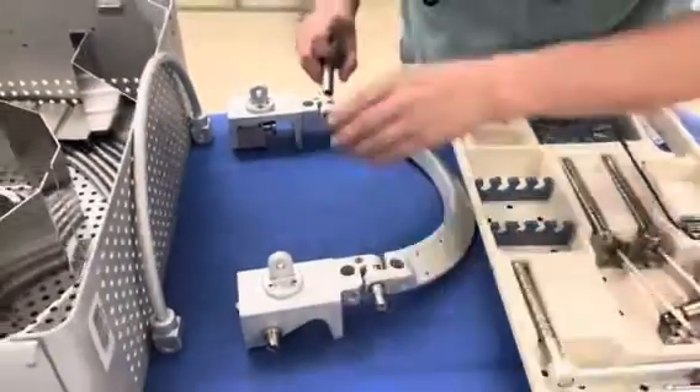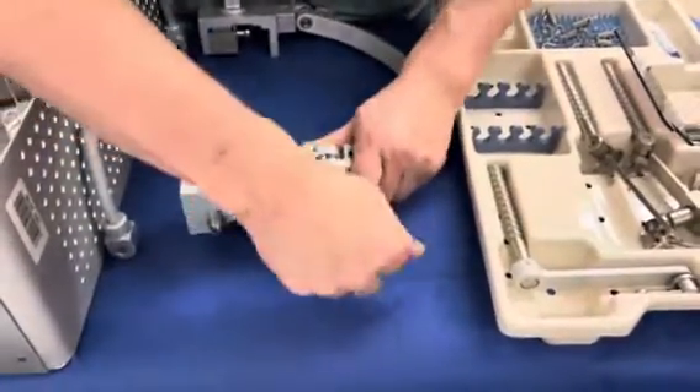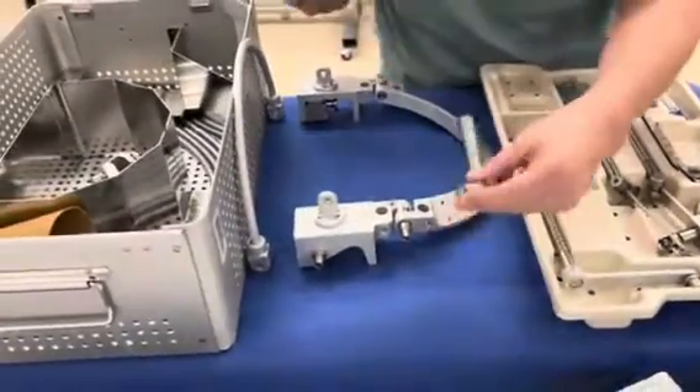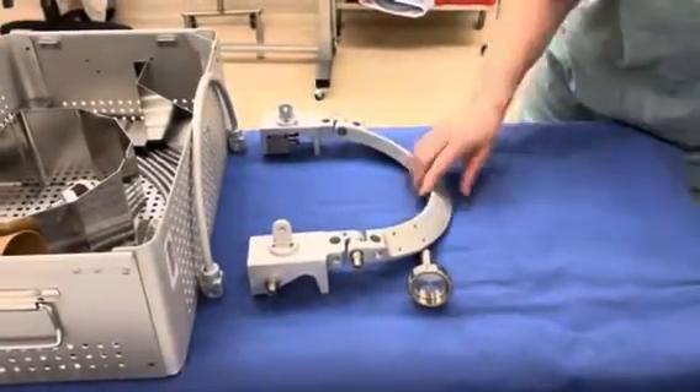Then we're going to take the wrench just to secure it nice and tight. Always have the wrench nearby too, because if the surgeon wants to lower it, they'll take the wrench to do that. Just give yourself some extra room.